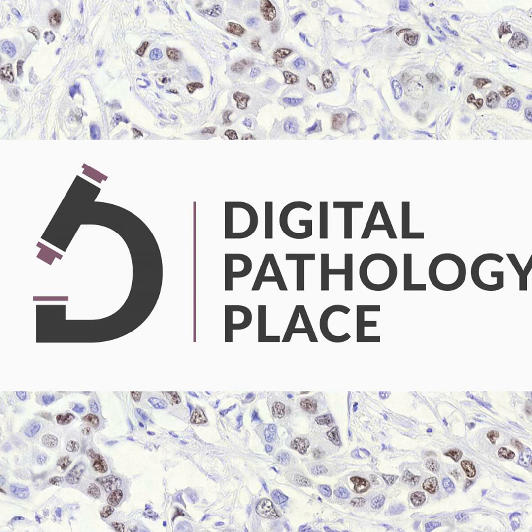All of these things have to happen. And the only way they can happen is if you know what's in your images. Now, we use DICOM to help us determine that. DICOM is a structure that says, in general, what is in the images, but it's not perfect by far. You could probably drive a truck through components of it. So we have to create a whole other system to make sure we're getting the right images there. And that's what I call data orchestration. It's actually quite difficult. I'll pause there for a second because that's a lot of information.